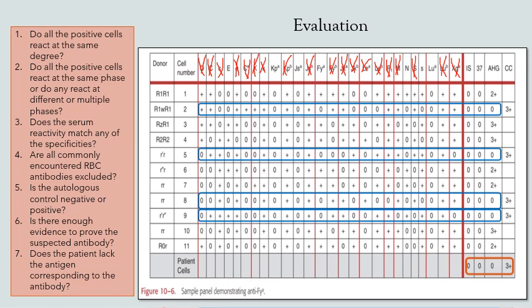Next, excluded, done, already done, FYB done, JSA done, LEA, P1, M, S, Neutralization. Here, we can exclude small s. Okay. Let us check again. We could also exclude M. That is why, guys, we really need a ruler for this so that you are not confused.